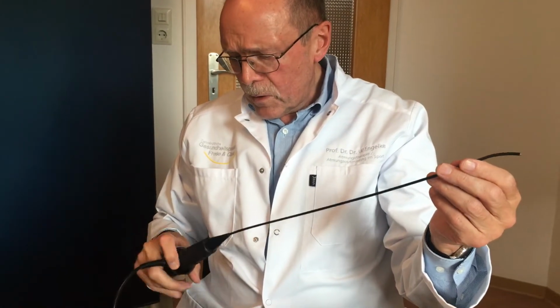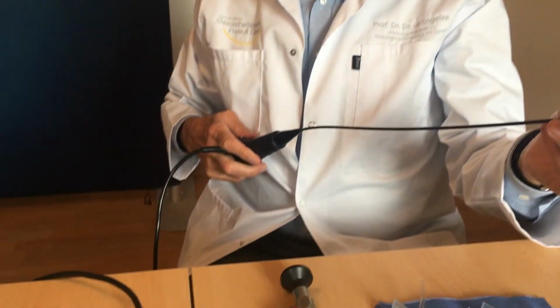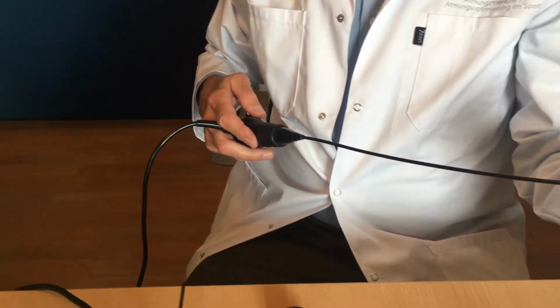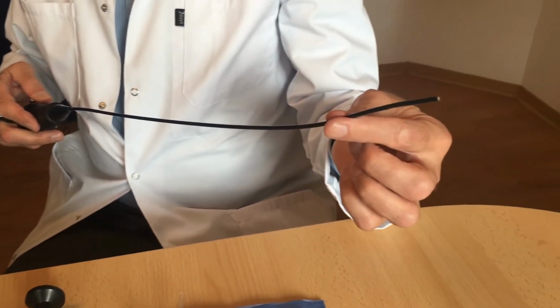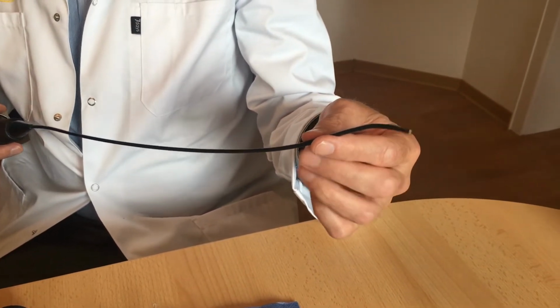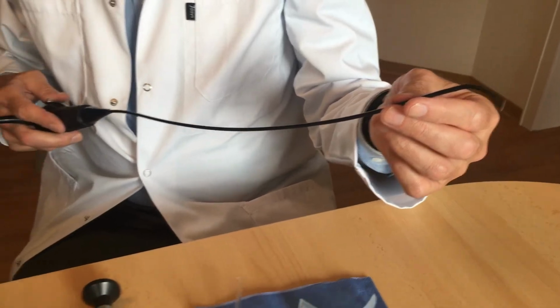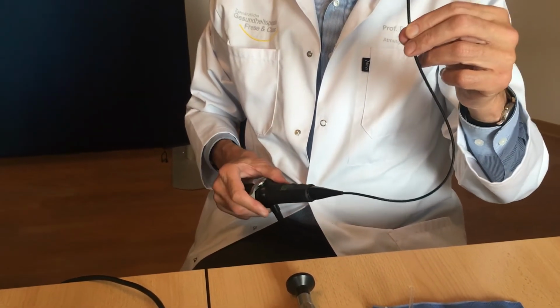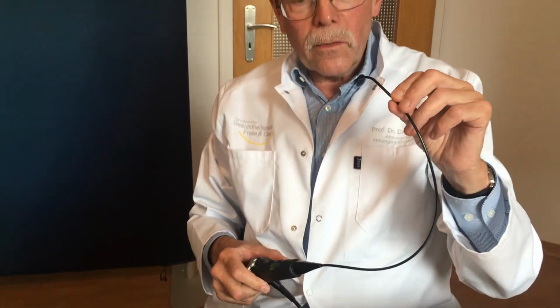I also have got a light source for it, but I'm just showing this procedure without connecting it to the camera. This flexible endoscope can be placed through the nose in the position of the superior larynx.